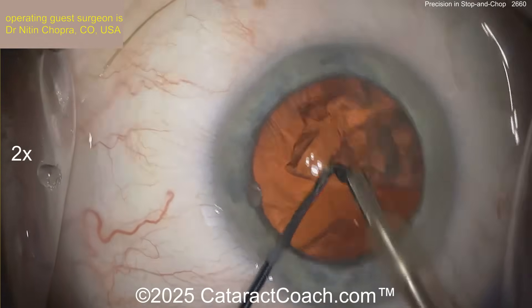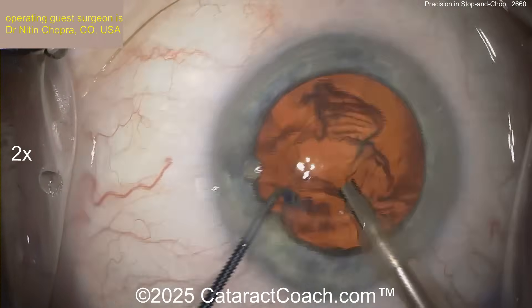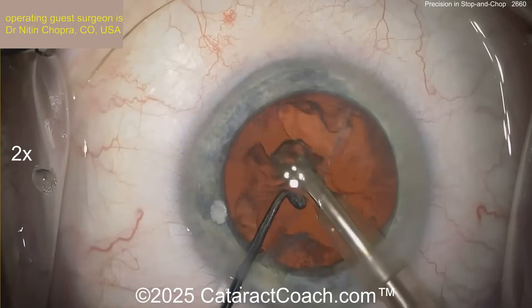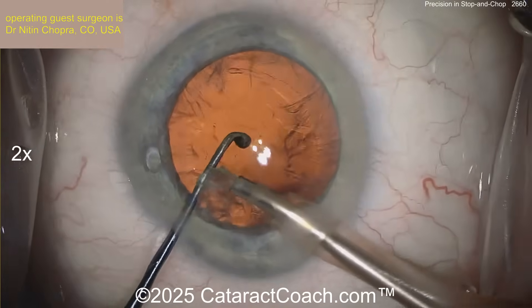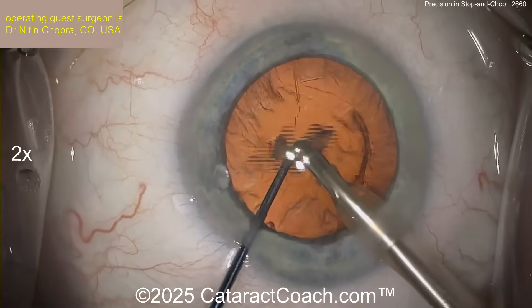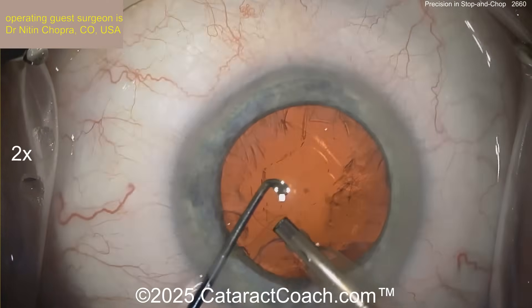It's one of the techniques you learn on your road to being just a chop surgeon. Eventually, I think most people have learned all the techniques. Everyone started off at divide and conquer, then stop and chop, and then eventually they just go to straight chop. A chop technique tends to be really the most efficient of all — and it's a lot of fun. I enjoy doing this surgery now, even decades later.